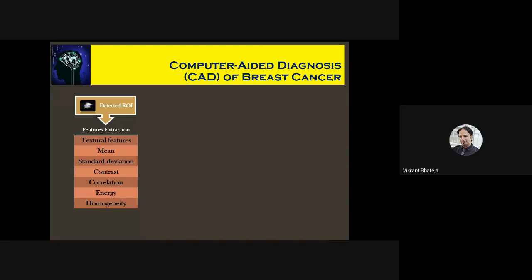Your ROI is an image, and now we are converting that image to a vector form or a number form, so that it can be directly made input to a classifier or a machine learner. Now, out of these features, there could be certain features which may be redundant, and we may want to go without those features.